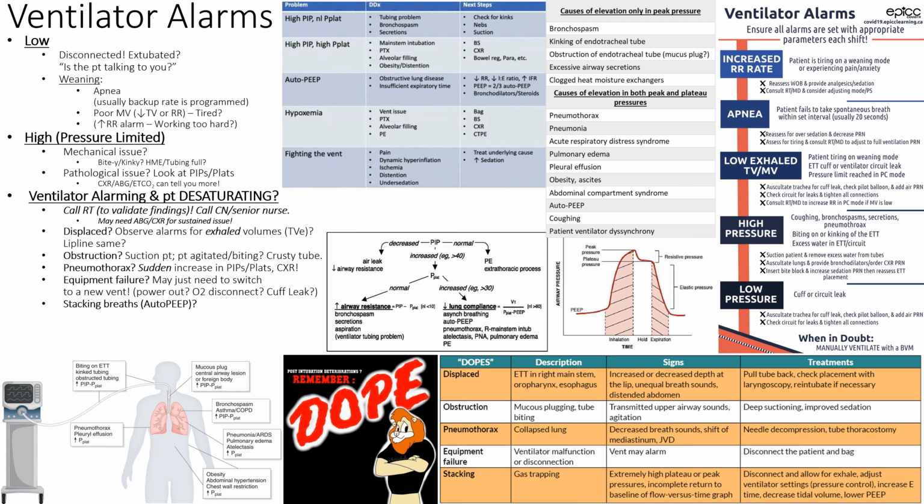When you say 8/5, you're talking about IPAP. Think of 8/5 as the 8 being the IPAP, but it is true, it's 8 in addition to the 5. Whereas in BiPAP terms, it's go to 8, come down to 5. But in pressure support terms, it's start at 5 and go 8 higher. Go back down to 5, start up 8 higher. So it'd be like 13/5, right?